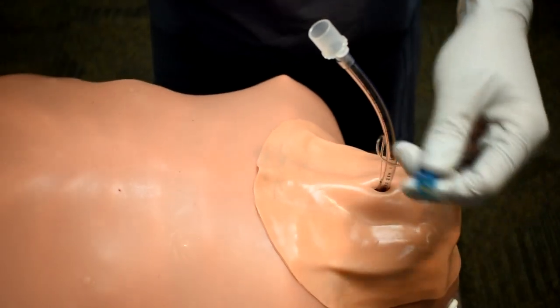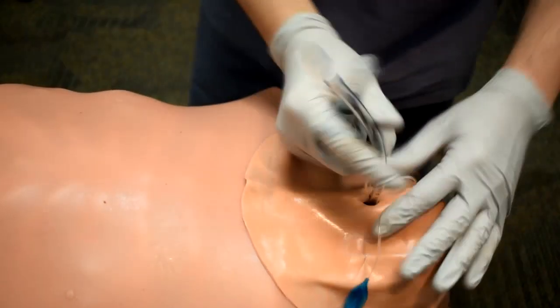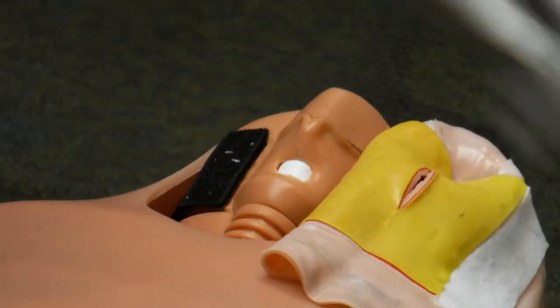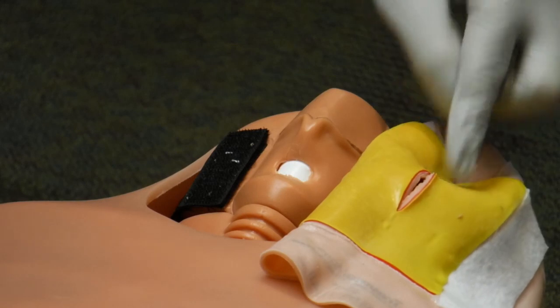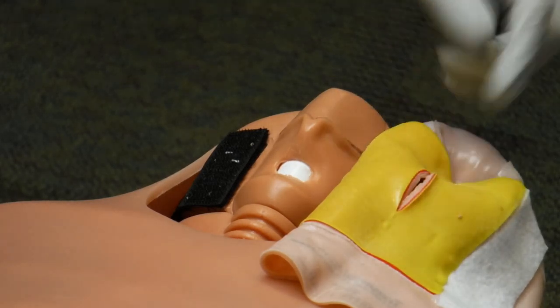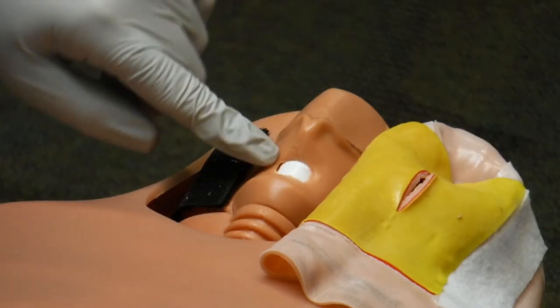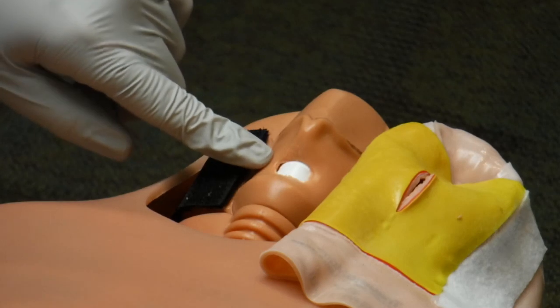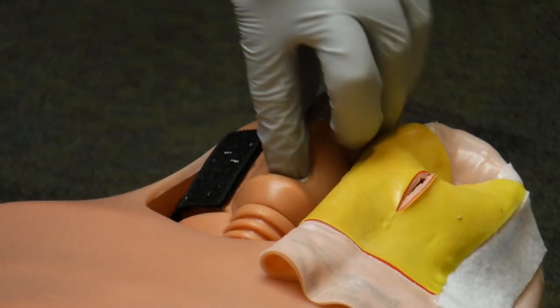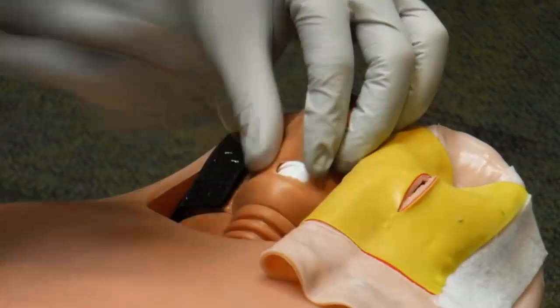The last demonstration I want to show is just what it looks like without the skin on it. So I'm going to take this tube out. We're going to open the skin again. I've already made my cuts. You can see that the cut has been through every layer. So we're staying in the midline, so the skin, and then all of the layers in the midline of the neck until we get down to the airway. You can see my horizontal incision in the cricothyroid membrane, and I'm able to stick my finger inside to dilate, or I could stick a clamp inside to dilate.